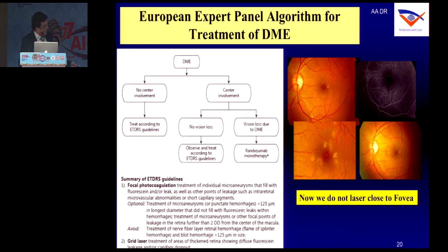I alluded before this that if you have a central involving diabetic macular edema, we don't go ahead and this is the laser which I had done way back in 2004. You can see how close to the fovea we used to go when we didn't have anti-VEGFs available. These patients used to do well.